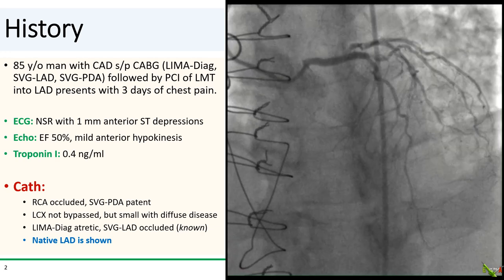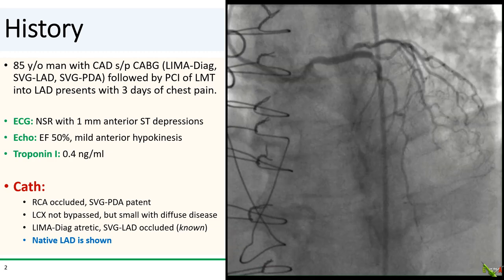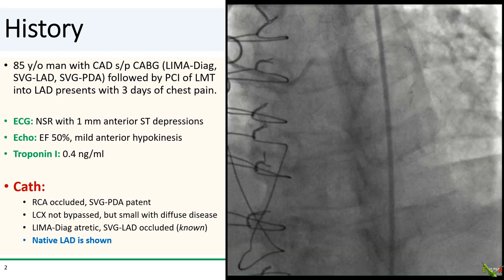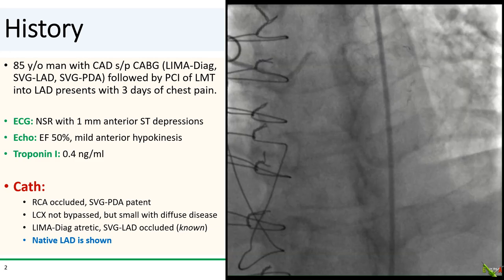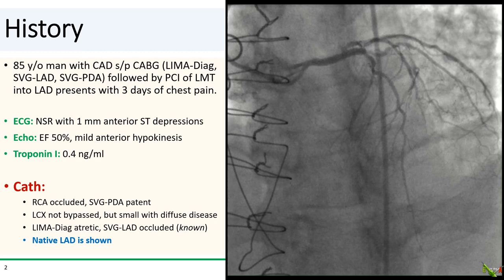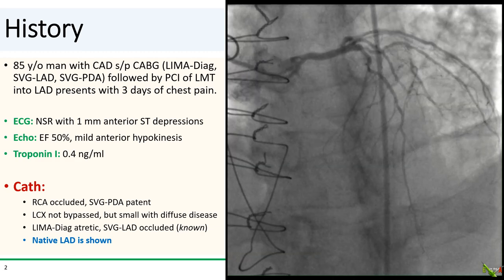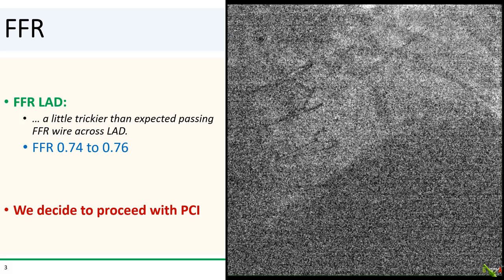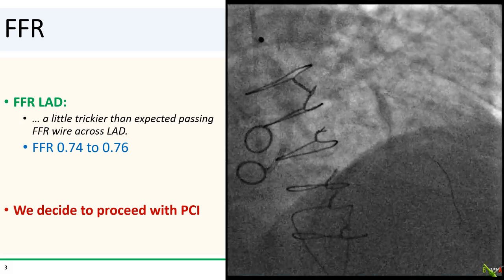The LIMA to the diagonal was atretic, and as expected, the vein graft to the LAD was occluded. The native LAD is shown. We see that the proximal stented segment is widely patent, but there is a segment of moderate to severe disease in the mid-LAD. We were not overly impressed with the LAD stenosis, so we decided to perform FFR.